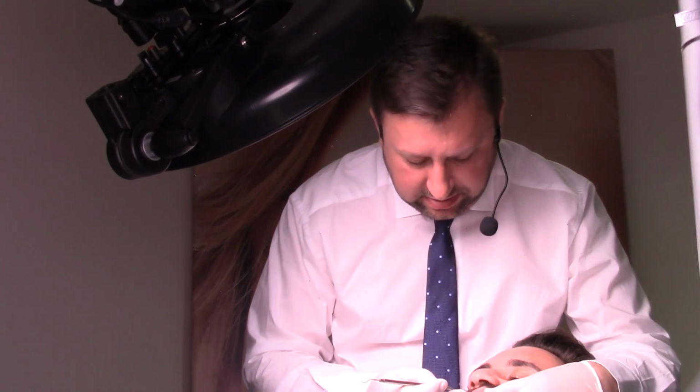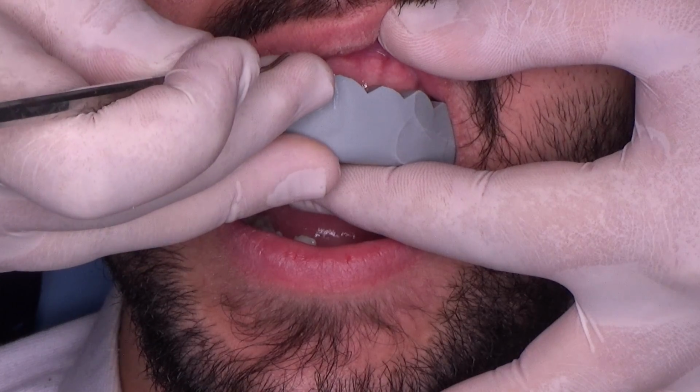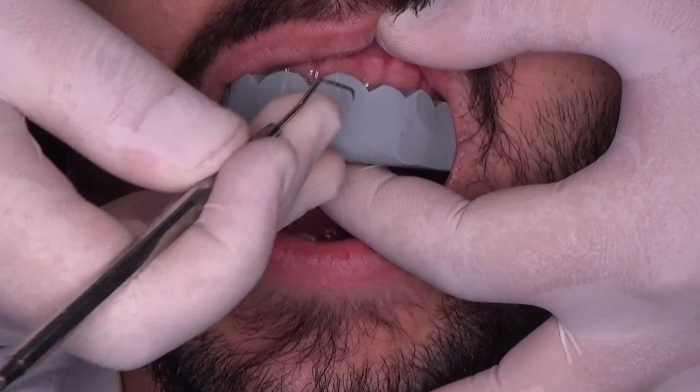Okay. Yes. So before removing this, you have to slightly open the silicone. You see what I'm doing? Otherwise, everything will fall out.